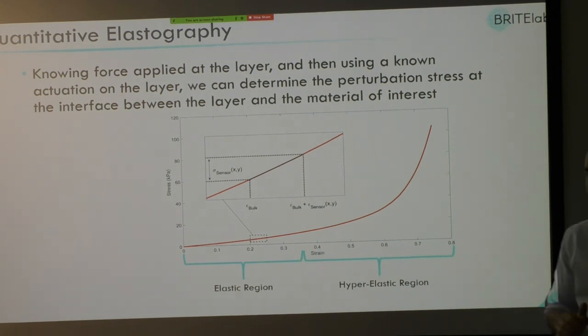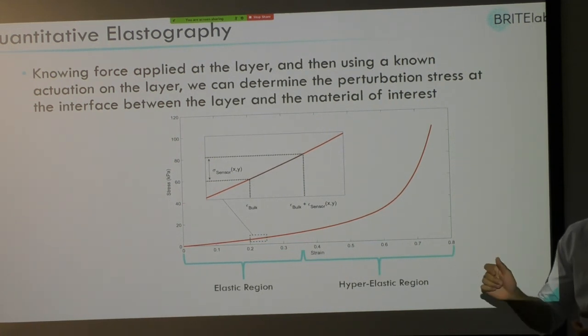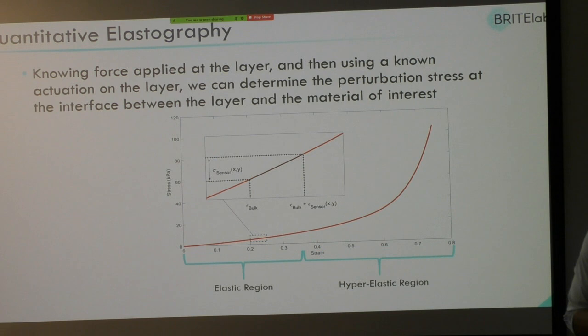And the other thing is, how long do you think it will take to get this into the clinic? There is a handheld probe being designed. I think the researchers are actually doing the scans at the moment in surgery, intraoperatively, so it's happening right now, I think. The other question I had you answered, about the tissue differences in real patients compared to a phantom.